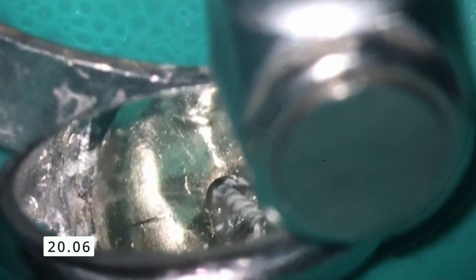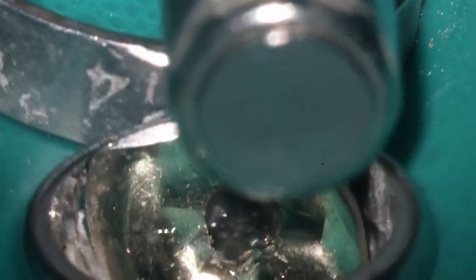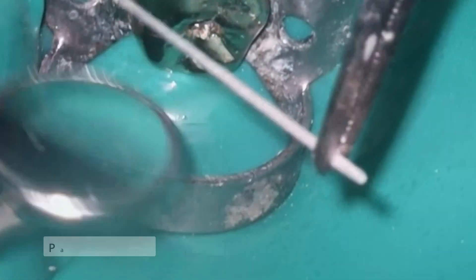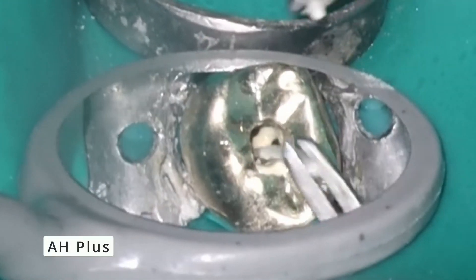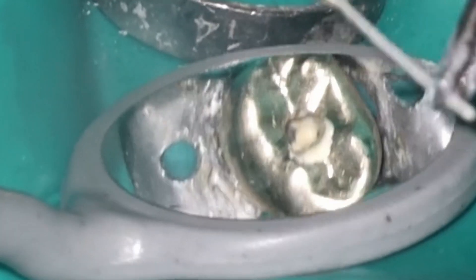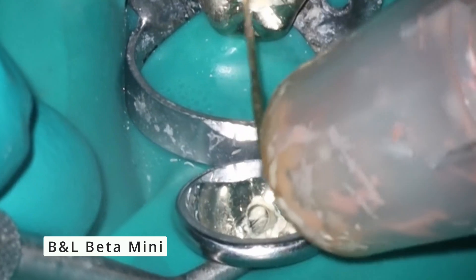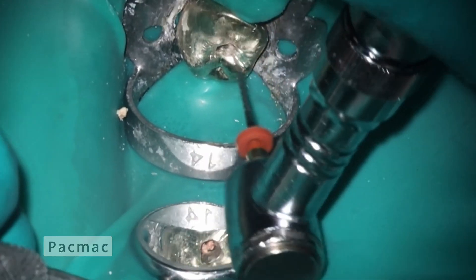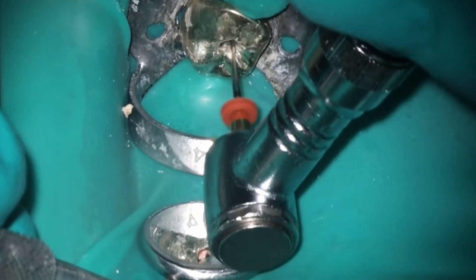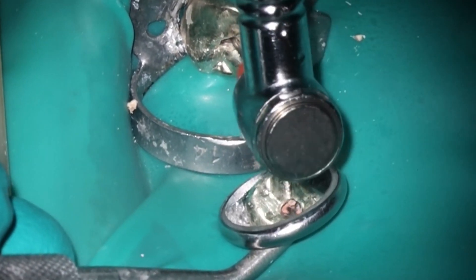No vertical fracture all along the distal. However, I did see that there was a tiny little almost fin that I wanted to clean out, so I went back in with the 2006. I found that this is a case where sometimes using a slightly larger, more aggressive taper is superior to using something like a 1704, because the goal is to make everything coalescent to one. You'll see in the final — that's kind of what the distal looks like. Drying with paper points, you've all seen that before. Then we're going to do the squirt technique. When you're squirting a case like this that has a larger apical finding, the key is to not use as much pressure and to hold off on the Pac-Mac until you take your working length film. With the backfill, we really don't want to do too much aggressive pressure. I'm working on getting a video together on the squirt technique using clear blocks so you can actually see how it works. Going in now with the Pac-Mac — there were a couple of voids in there, and I just wanted to help that distal coalesce into one solid unit.